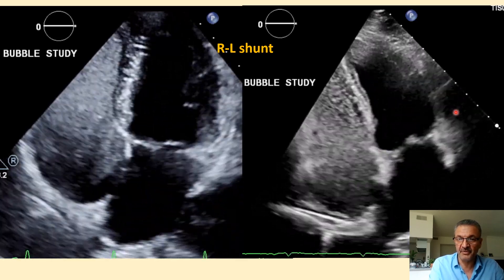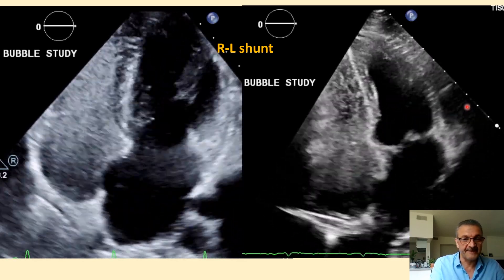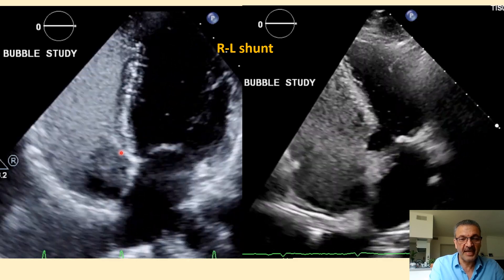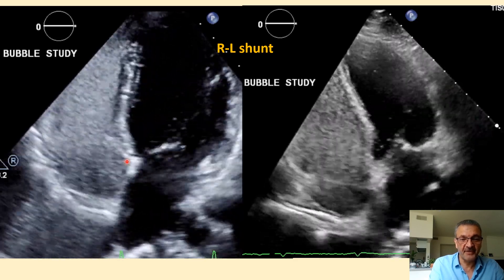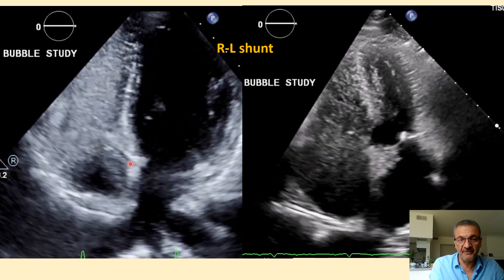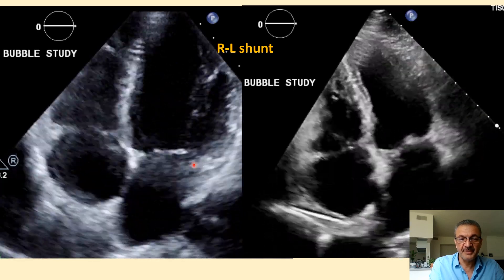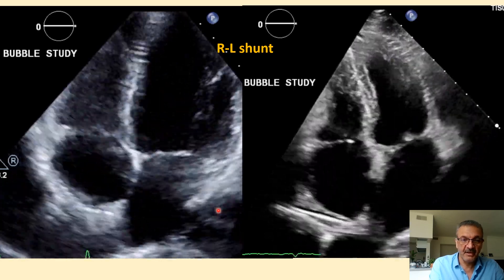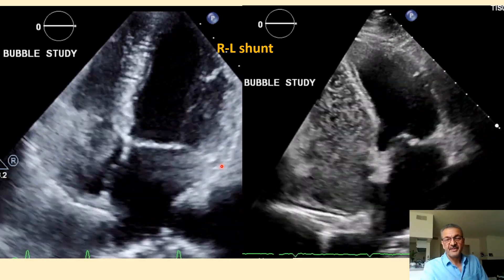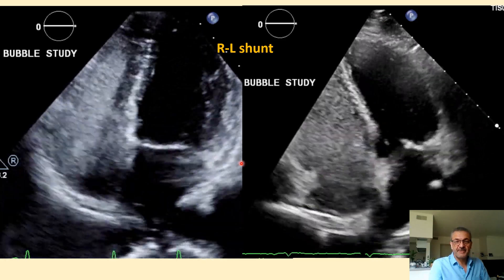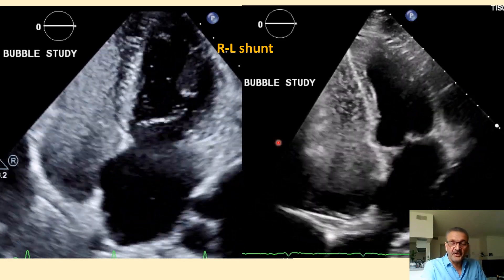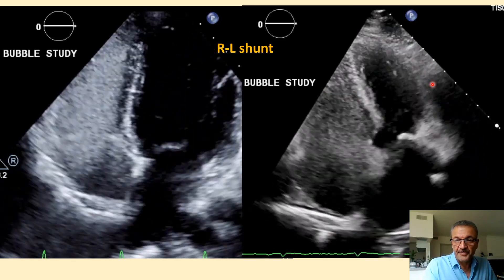There you go — you can see it there. This patient: bubbles show up right after coughing. I asked the patient to cough, and right after the cough, bubbles suddenly rush into the left side. So in this case, we have a right-to-left shunt.